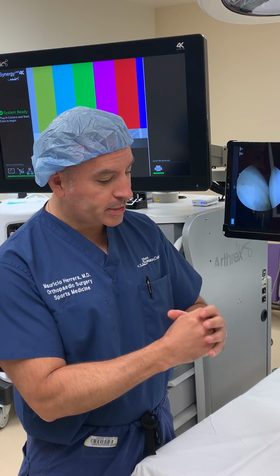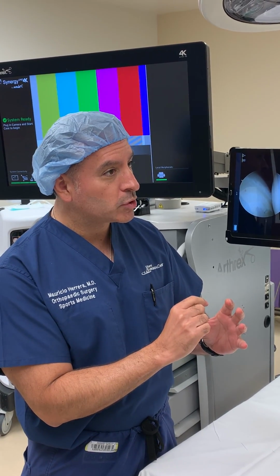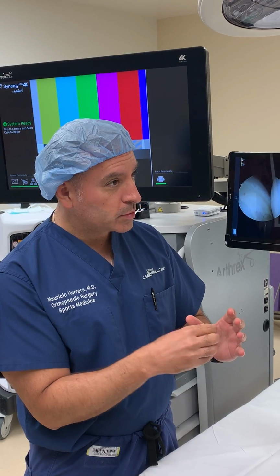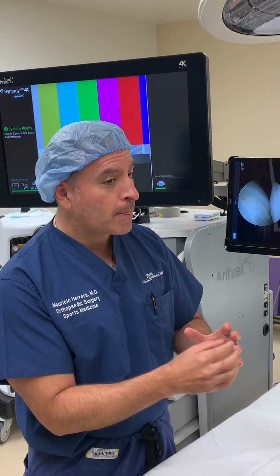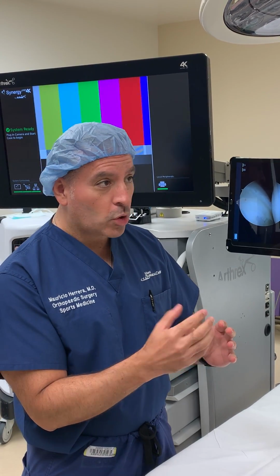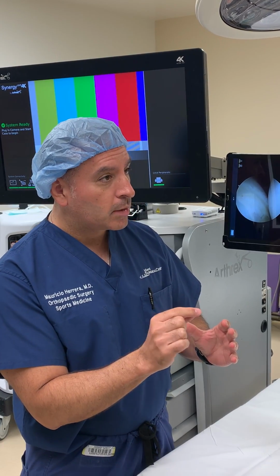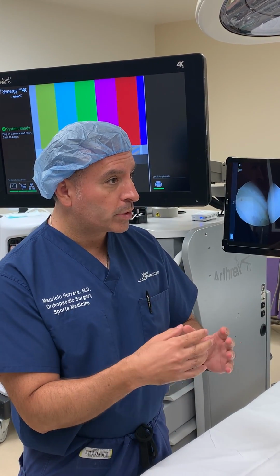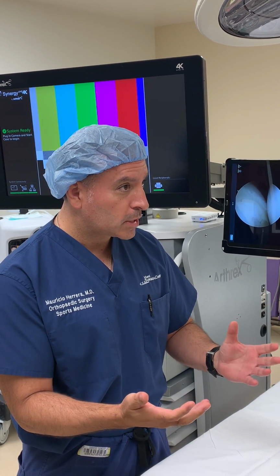Your hip joint is a ball in a socket, and on the edge of the socket you have the labrum, which is a piece of cartilage. A lot of times that'll be torn, so during the procedure we can fix the labrum and reattach it to the edge of the socket. Generally we'll use what are called suture anchors. Suture anchors are small screws made out of calcium and bone, which will dissolve over 2 to 3 years. We really are not using metal screws anymore.